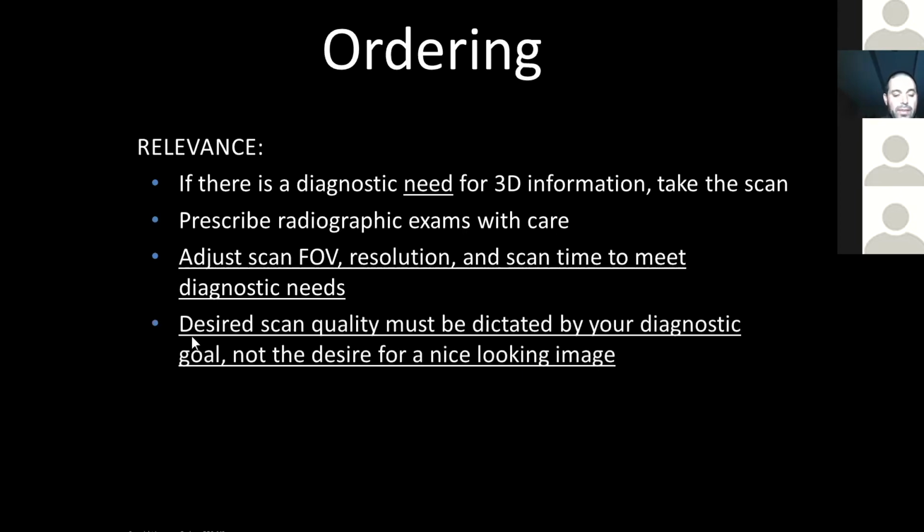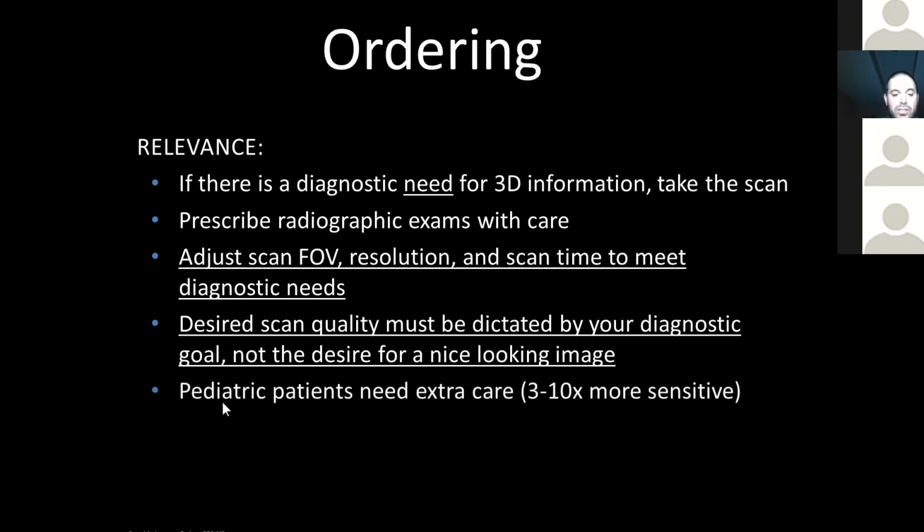Okay. What I'm ultimately saying is your scan quality has to be dictated by your diagnostic goal, not the desire for a nice looking image. And again, remember our pediatric patients need extra care. They're anywhere from 3 to 10 times more sensitive.